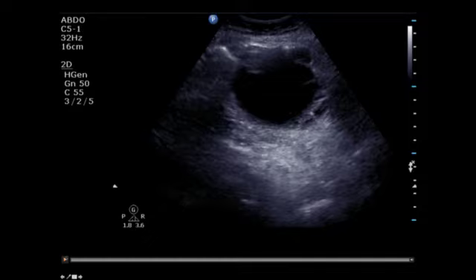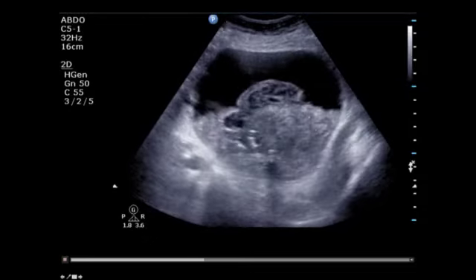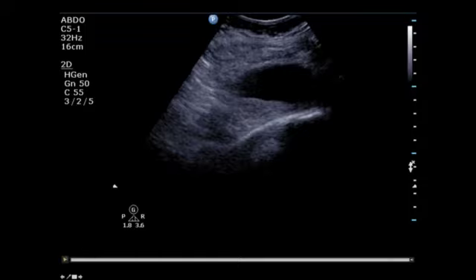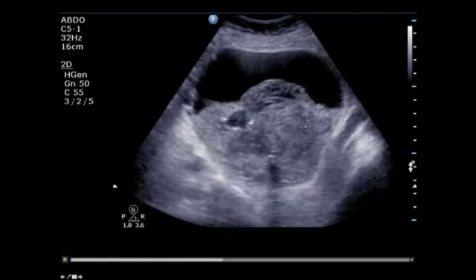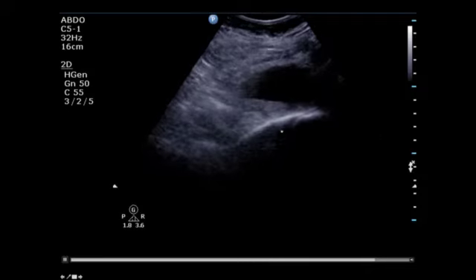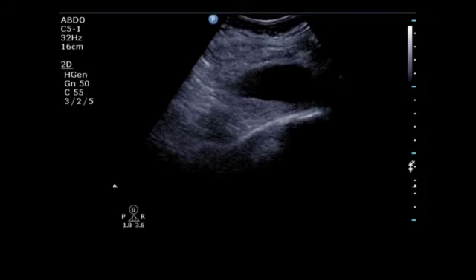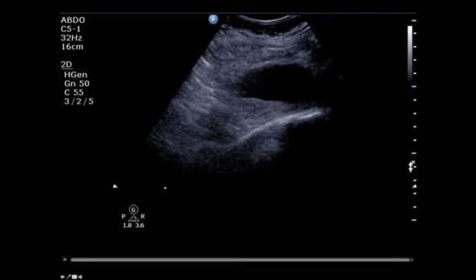This is a trabeculated bladder, and you can see it's full of blood clot, and this is a catheter balloon. Now, again, you might think that that looks just like the tumour, and in fact it does. But here we have the catheter, the patient's got frank hematuria, and this is all blood clot. And that needs to get washed out with a 3-way catheter, and you may well need to do a proper vigorous washout with a 50ml catheter tip syringe, putting fluid in and out to try and break that clot up. But again, it's difficult to determine whether there is or isn't underlying malignancy there.